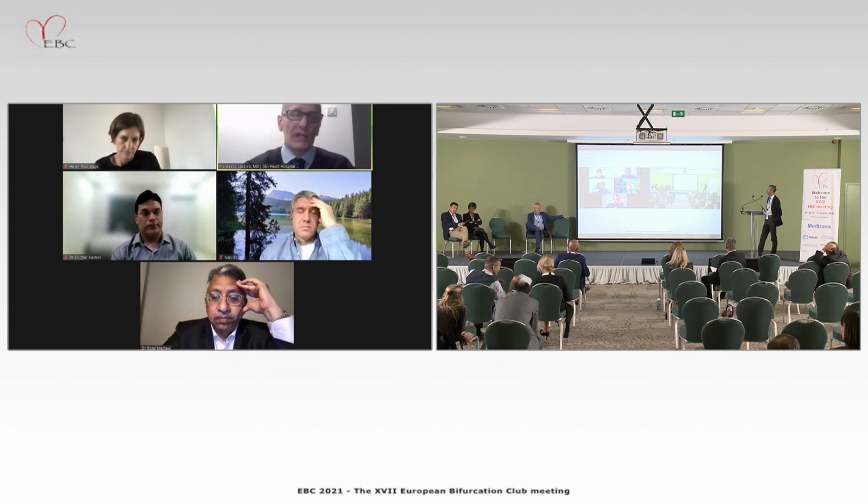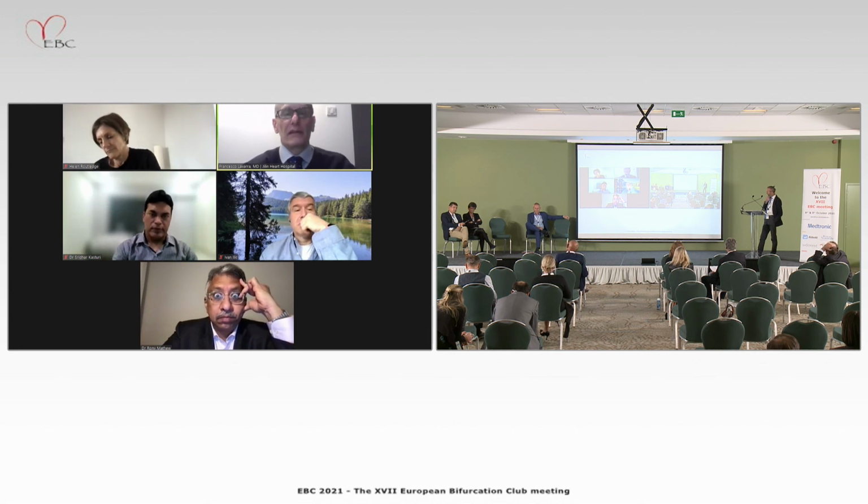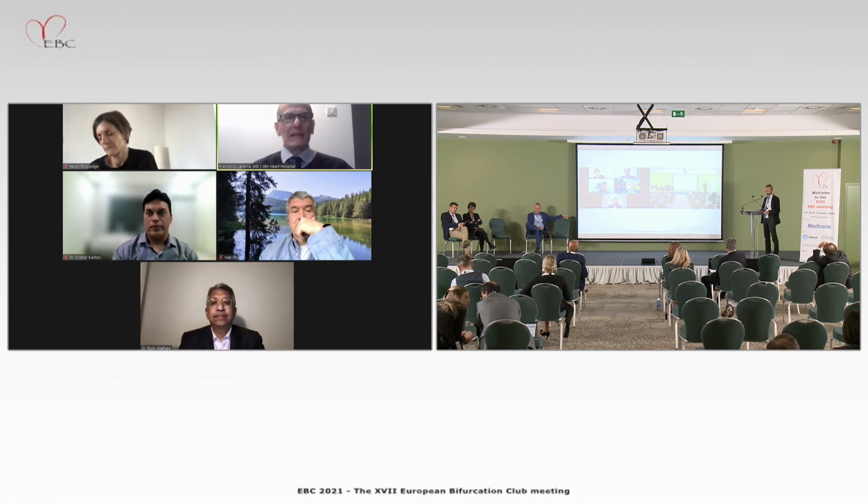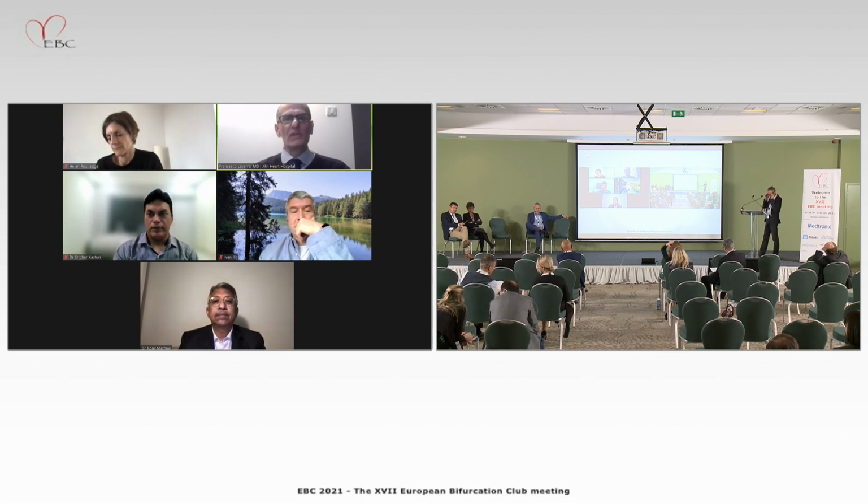And actually, I listened to the presentation of Renu Virmani just before, and Akiko Maehara, and also of Professor Greg Stone, and I think an experienced operator that did this procedure didn't make a big mistake at the end. The patient is now on ticagrelor and will be called after another 3 months, so 6 months from the second procedure, and we will see what we will find on this bifurcation.